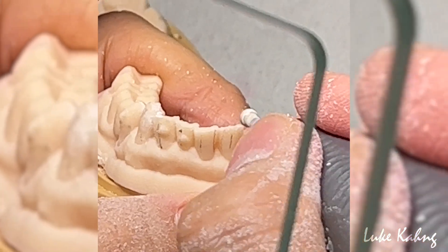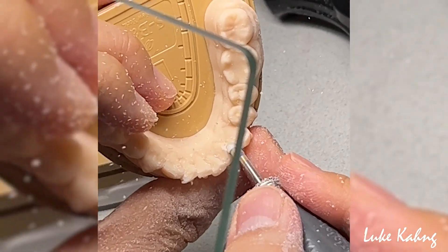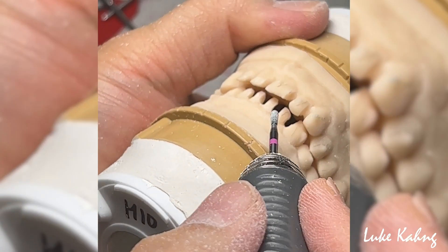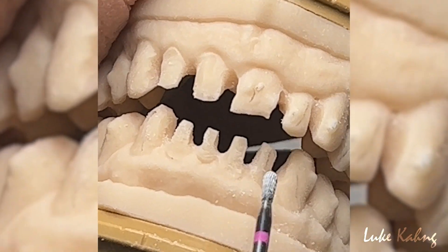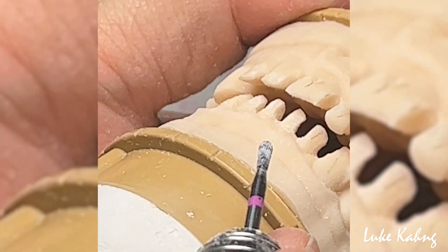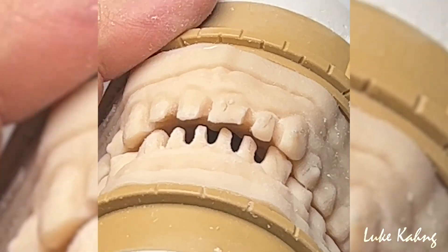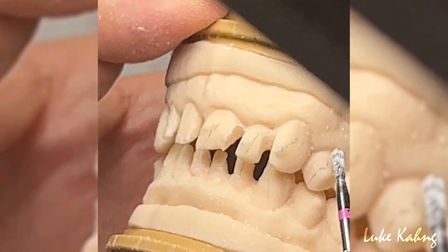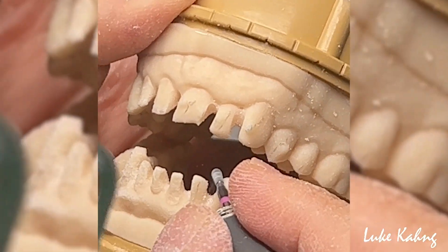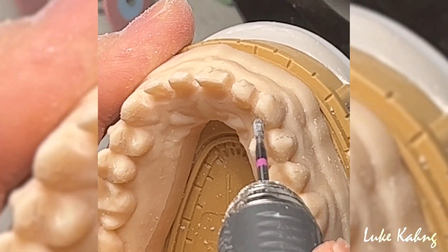This is my preparation. This is crooked, so I have to grind more here. Then I can make the alignment. I have to make room — this is proper, this is minimize it — maximize the tooth structure. So you have to eye grind, I have to grind more just a little bit. I have to grind the canine because it's too long — just a little bit cut it. This is final contour, that's good. This is already good contour, so I'm going to prep a little bit less.